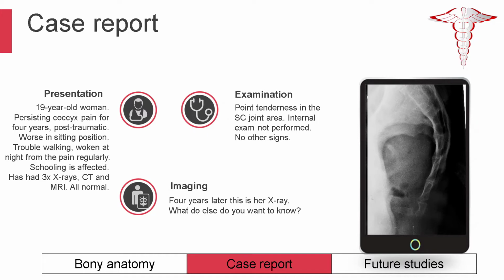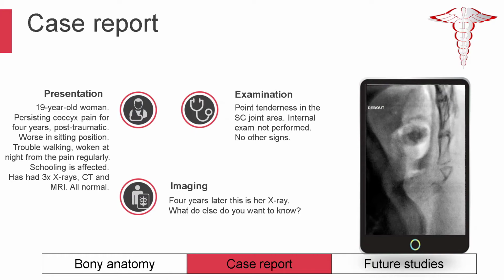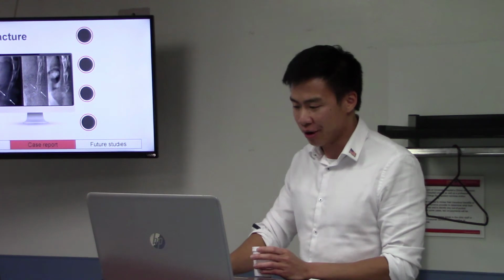Oh. Looks a lot different, right? Yeah. So she's lost the rectangular shape that she had on her initial X-rays, and now she's gotten more of a triangular shape. Yeah. That's what it looks like. And then this was, pardon the quality, 2 months after the injury. So we put everything side to side. That's the one from recently, and that's what we got.